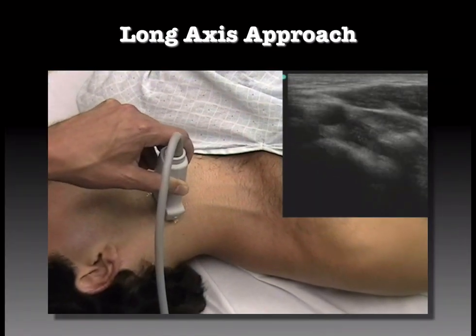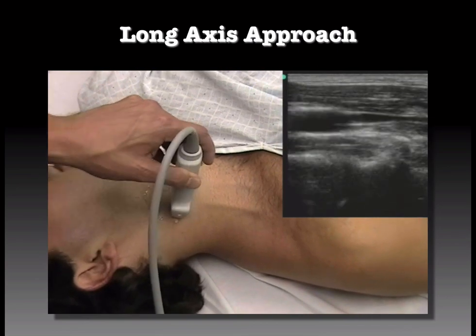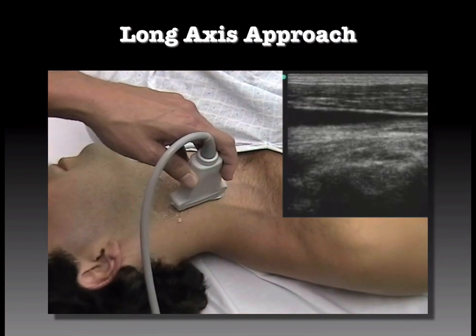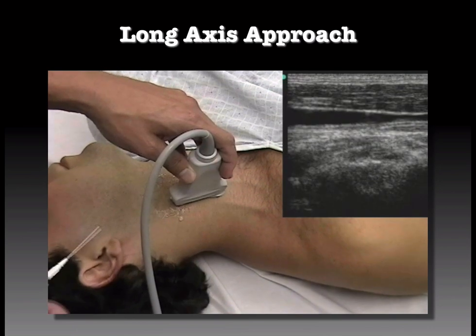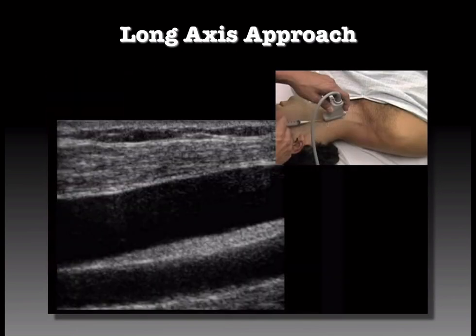Here's an example in a real patient. Again, we're compressing in short axis so that we know the vein. We keep the vein on the screen the whole time. So that's still the vein. When we get to long axis, we have the walls very bright. We insert our needle under the short face of the probe.